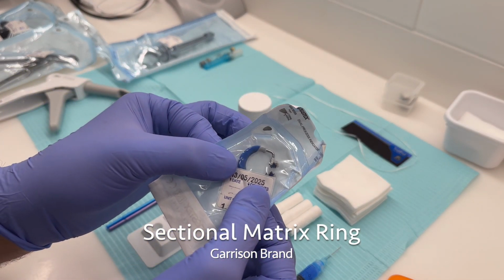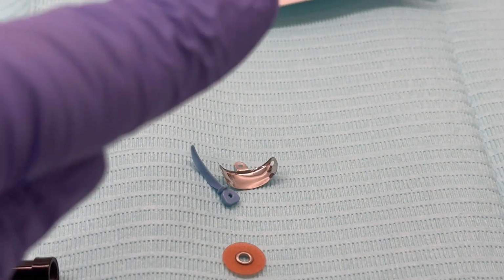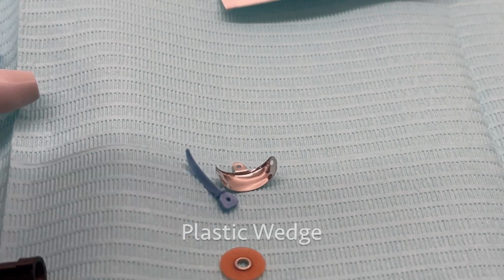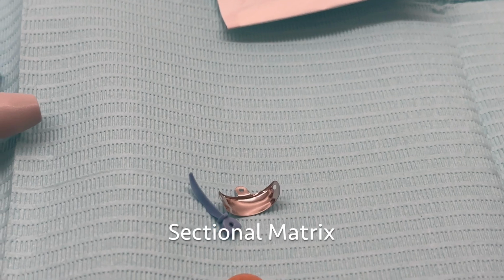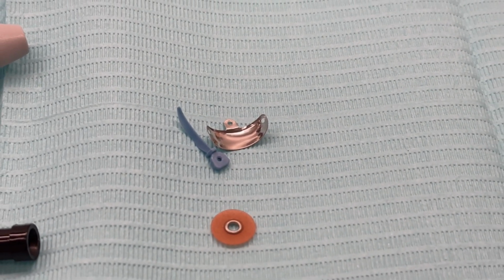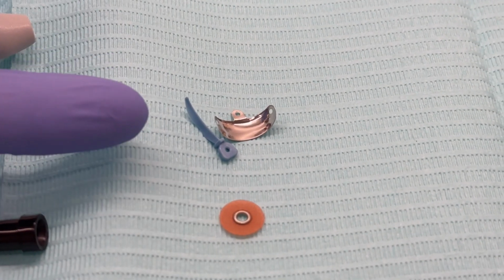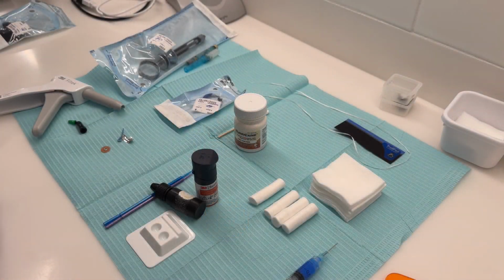This here is our sectional matrix ring. We use the Garrison brand at our office. It is used in conjunction with a plastic wedge and a sectional matrix, which goes in the proximal surface of the tooth. This tool is used to recreate the proximal surface using the composite resin. It's important to use the correct size when picking your sectional.